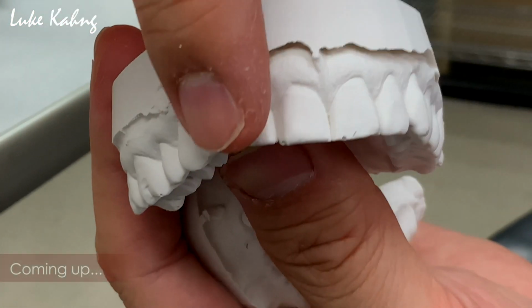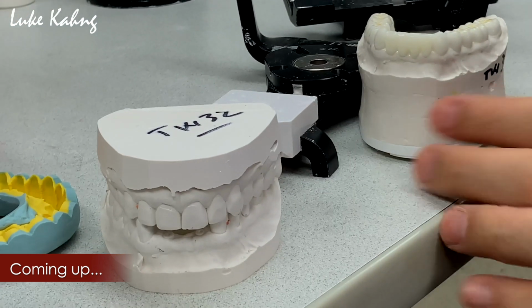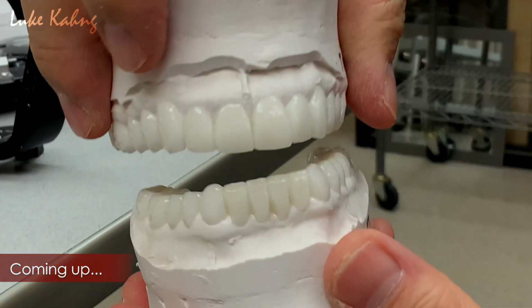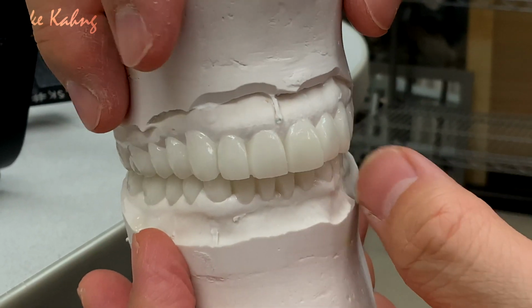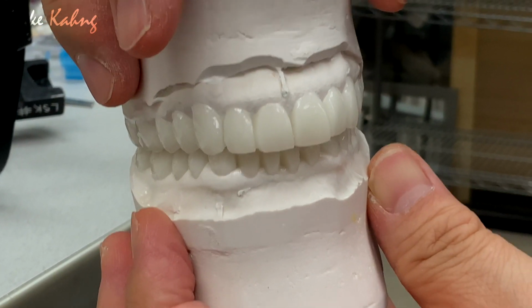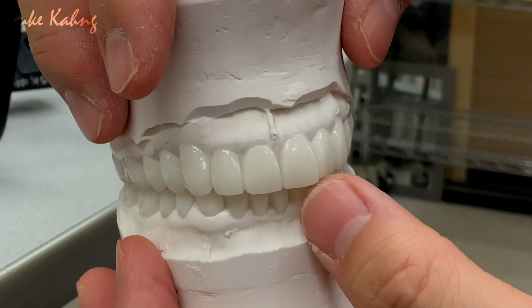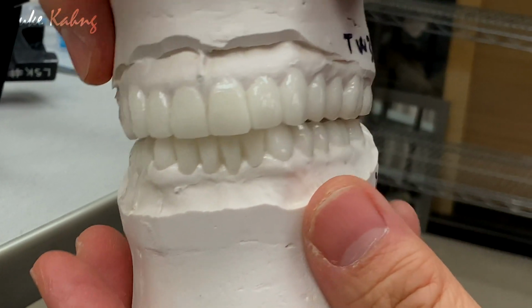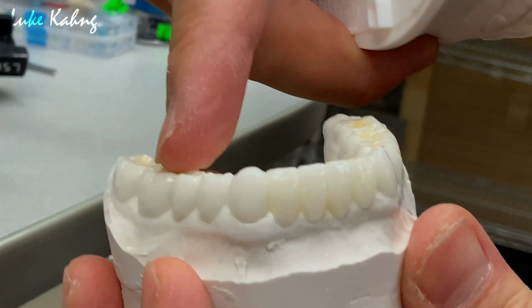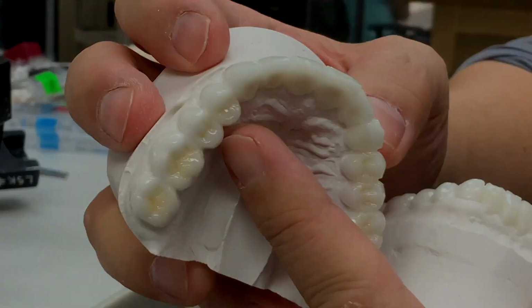And then we finish the upper with this. Okay, so we got the 6 through 11. So now we're talking about the shape and contour. Basically, I follow the patient's tooth shape and contour, which is square and rounded, with a little step down. As you can see, in my final one, once I set up, I rebuilt the occlusion with the tooth morphology.